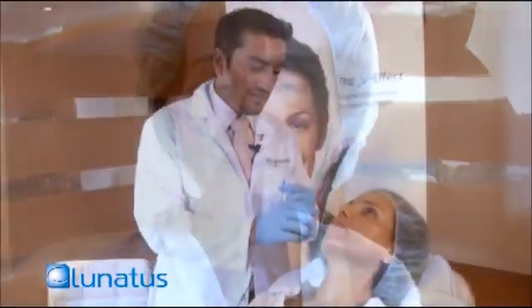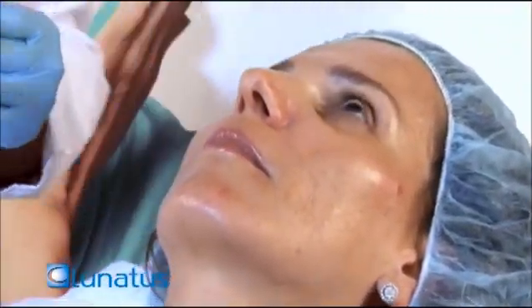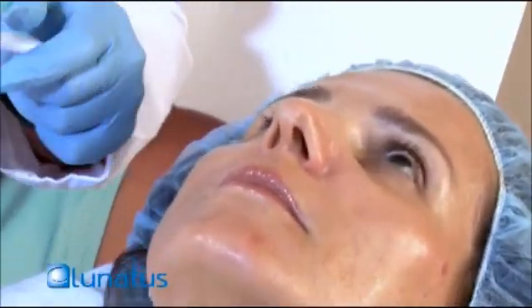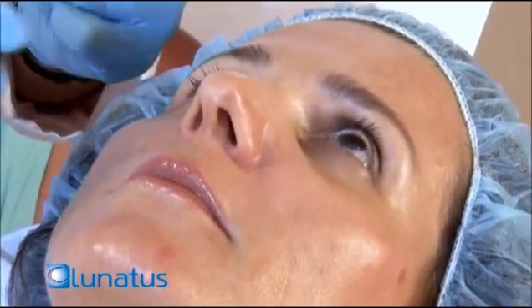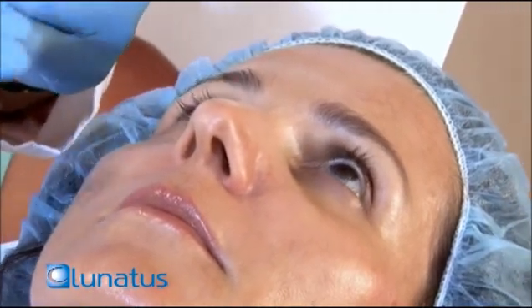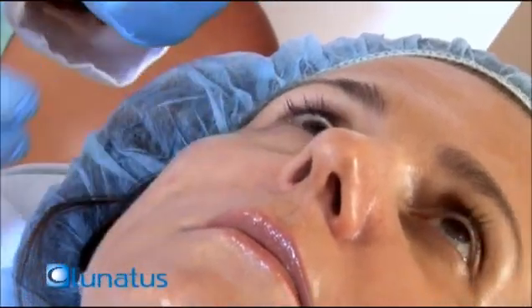Okay? Okay. All right. Okay, it's always very important to assess the patients while they're sitting up. Now I know exactly where she needs it. I'm going to be putting it where she requires it. Now, a lot of physicians usually mark the areas. It is not wrong to mark. Okay, so marking it with a surgical marker is completely fine. I tend not to do that.